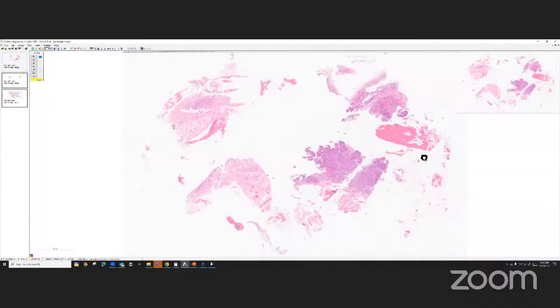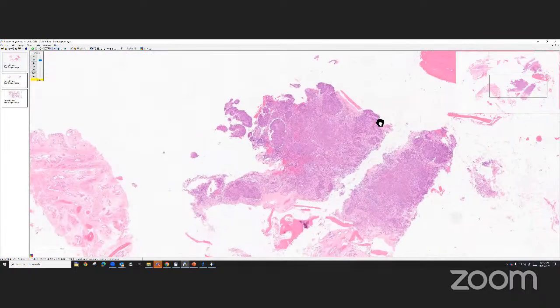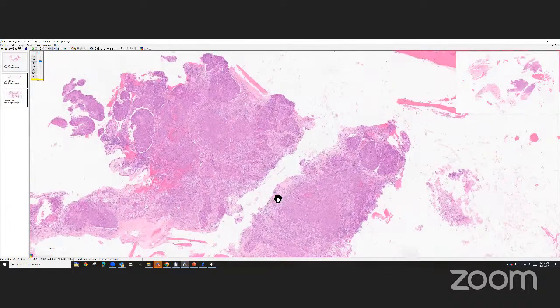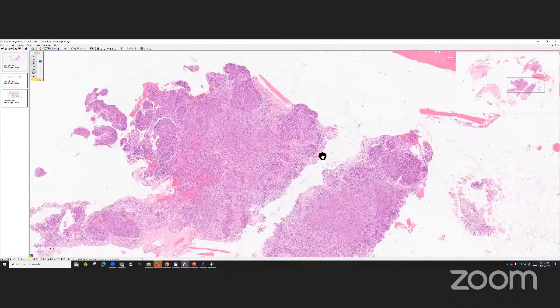Okay. And like these patients, we almost always get fragmented biopsies, right? Sometimes we get more tumor and sometimes we don't get very much. This one, at least, we have quite a generous specimen. And you can see on low power, of course, a blue cell tumor. And you start to see the nests, very low power. You can see these really big, really circumscribed nests, maybe a little bit of clefting here, okay?